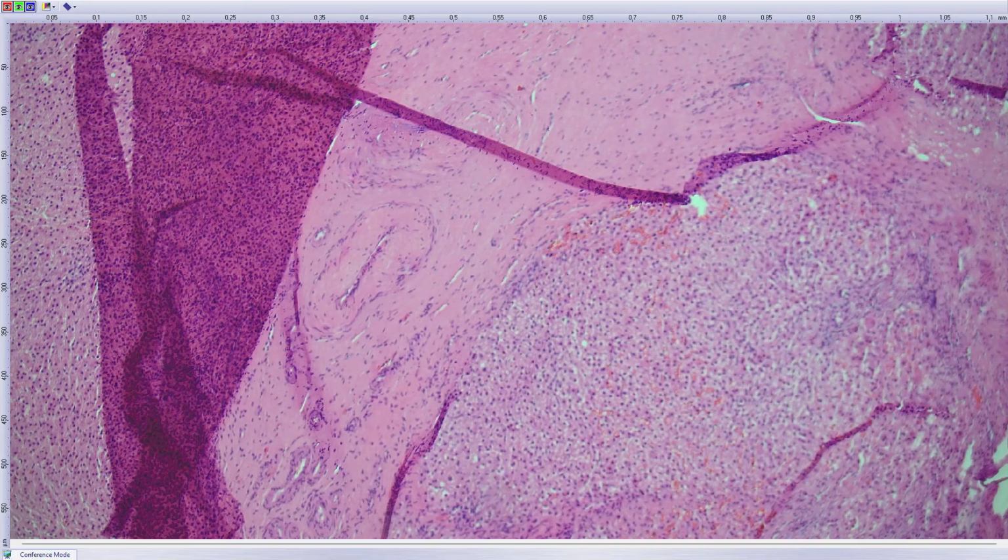It was confirmed that this is a polyclonal process, and this process follows some damaged process in portal vein, and it is considered as a local regenerative hyperplastic process.